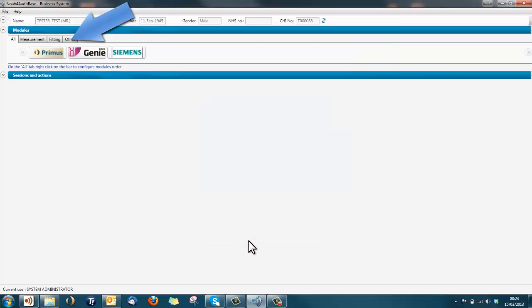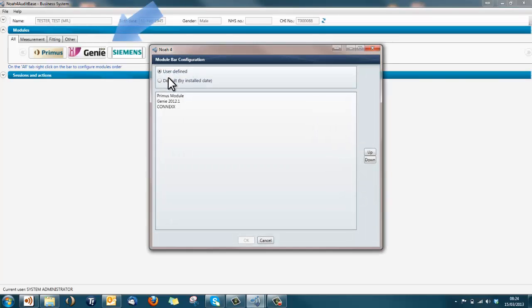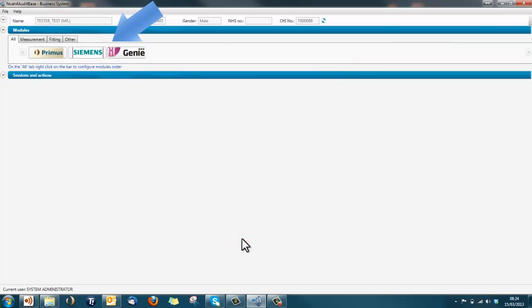The modules displayed in the modules bar will now be shown in your chosen order. If we again bring up the module bar configuration window, select the option for setting the module logos in the default order and the modules bar will display the module logos in order of the date they were installed.